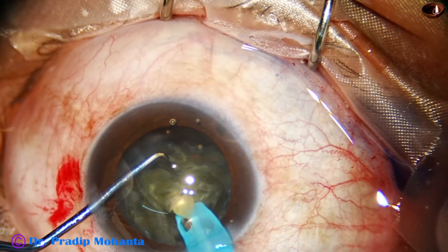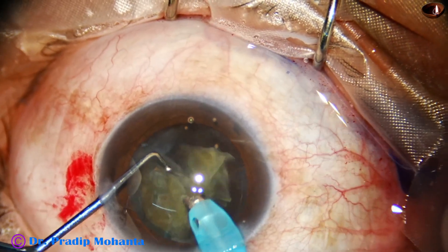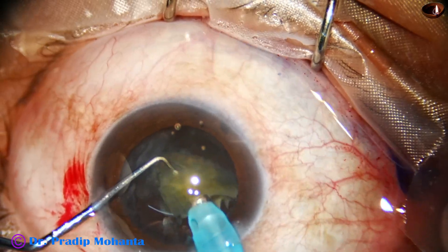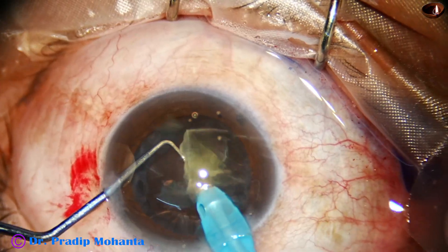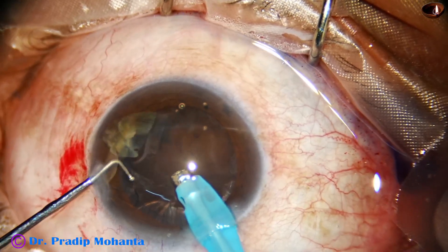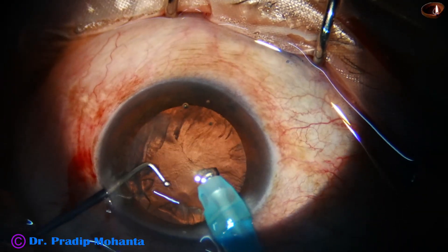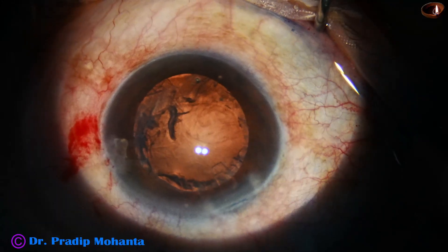This is the larger piece. Ultrasonic energy used is 70% in linear mode and continuous ultrasound used intermittently. This is the last nuclear piece. Flow rate is 40, vacuum is 400, and bottle height is about 50 to 60 centimeters. You have to be very careful, protecting the posterior capsule with the ball-tipped nuclear sustainer. The posterior capsule is intact.